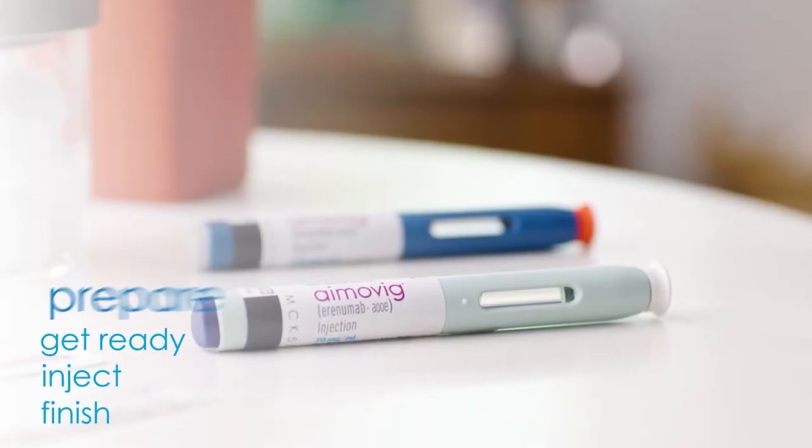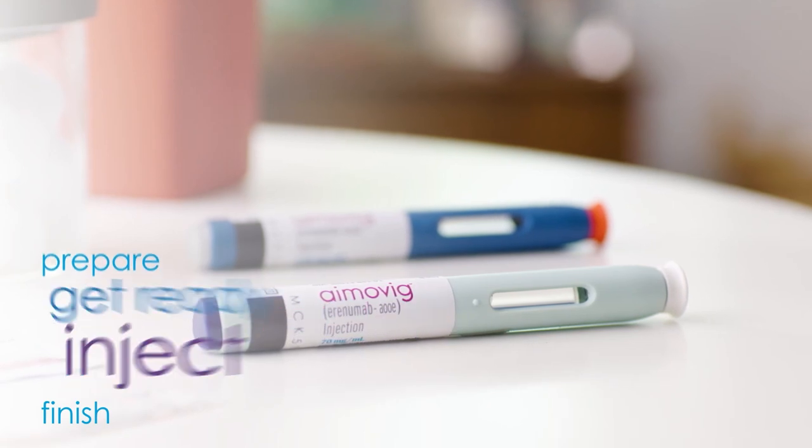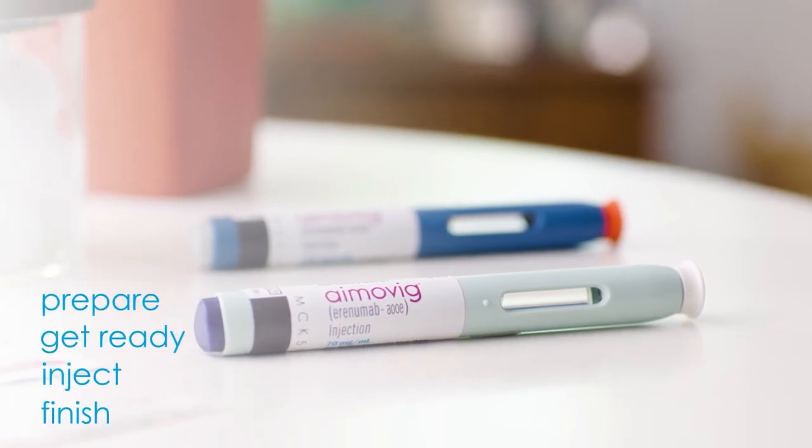So those are the four steps: prepare, get ready, inject, and finish. Injections are not my favorite, but taking a medication once a month that could help reduce migraine days is worth it to me. Take care.